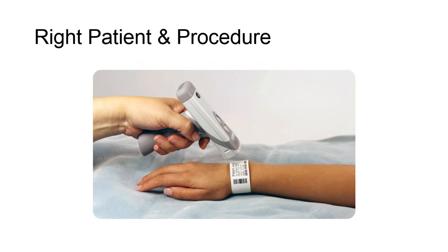While you may arrive into the surgical suite to set up your C-arm after the surgery has begun, you're ultimately responsible for a few things before you can energize the X-ray beam. You should always properly identify the patient and the surgery being performed, especially if you're not present for the procedural timeout. You'll need patient demographics to enter into the C-arm, and the equipment may take a couple of minutes to warm up. So I usually attempt to do this right after I've plugged everything in and pressed the power button.